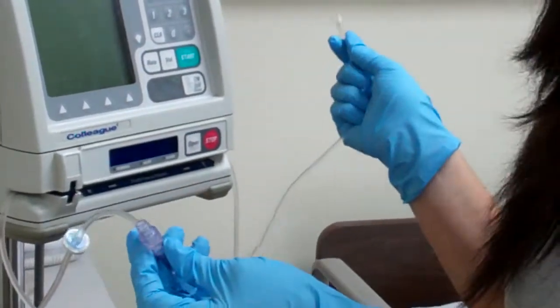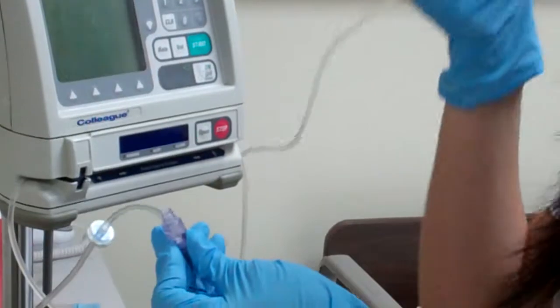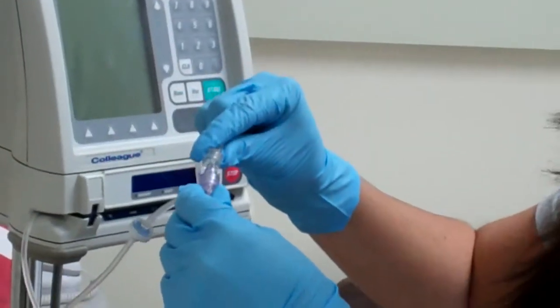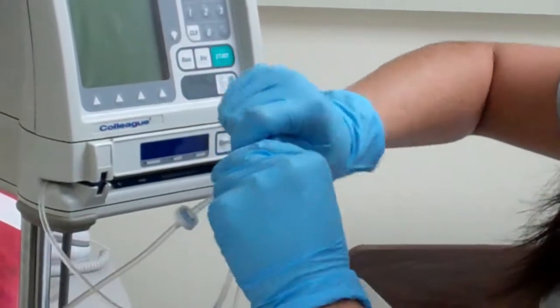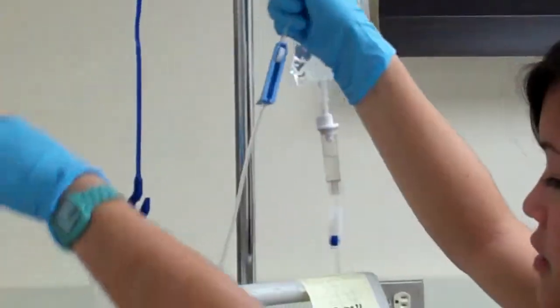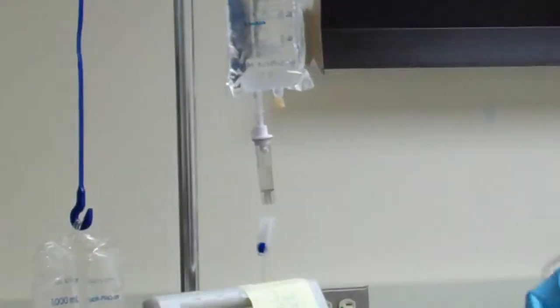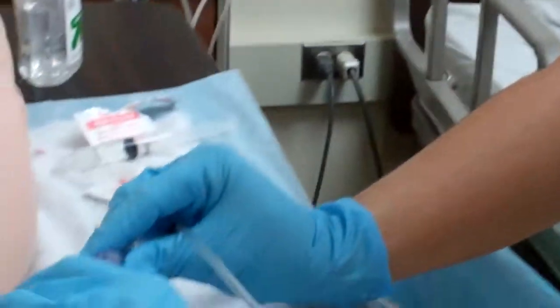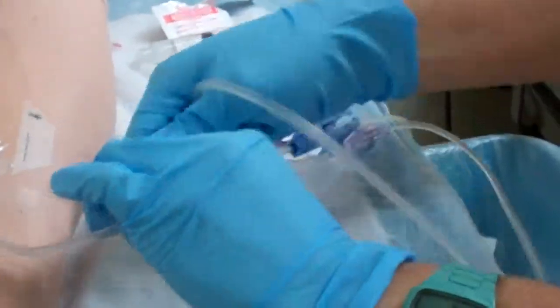And then let that dry for 15 to 20 seconds too. So it's dry, so I can go ahead and connect my line. This would already be connected for the patient, but I was just showing you how to test for patency.